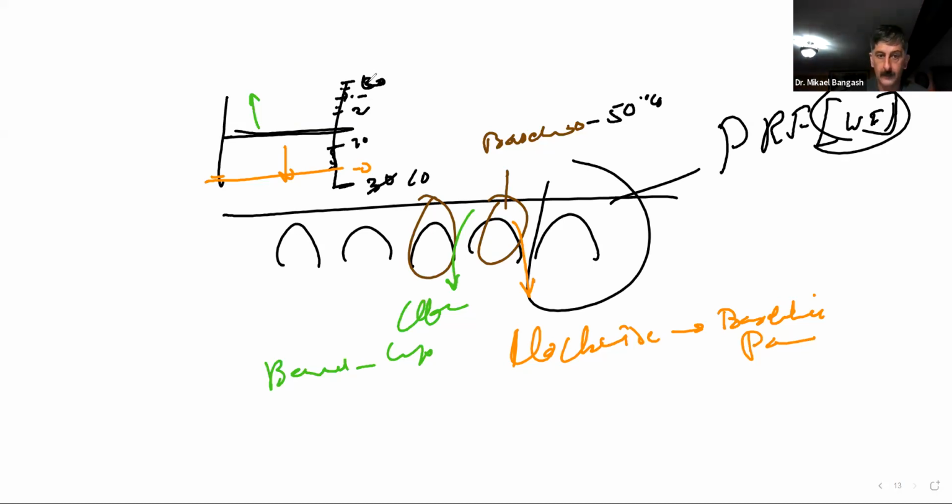Or if you bring the baseline up, you can say we brought the baseline up. Now this does become the new 0 Doppler shift, where this would just be 10. Then we go a new 10 here, 20, 30, 40, 50.